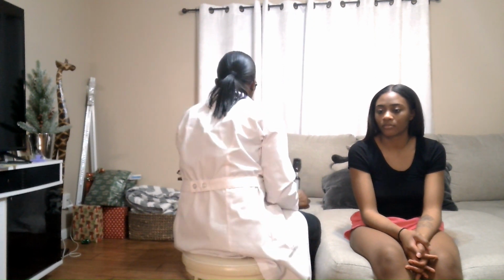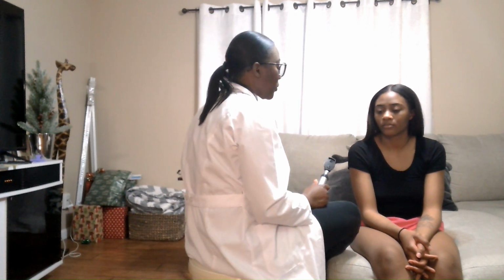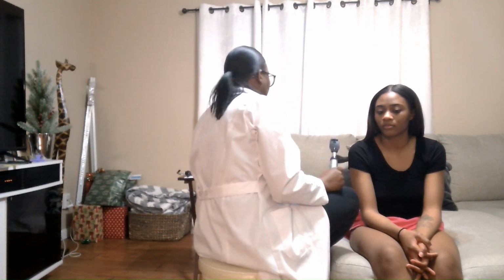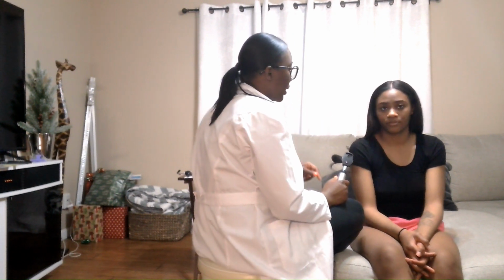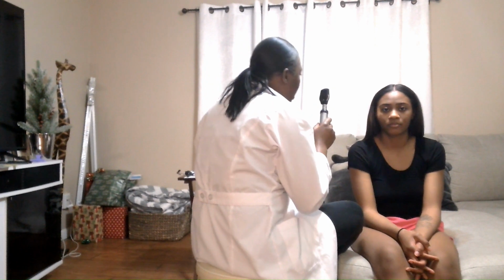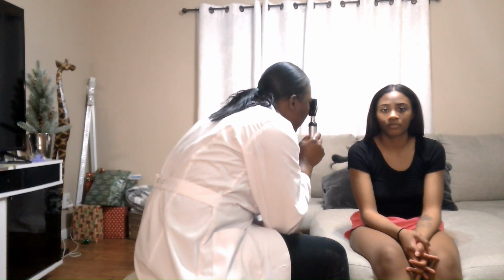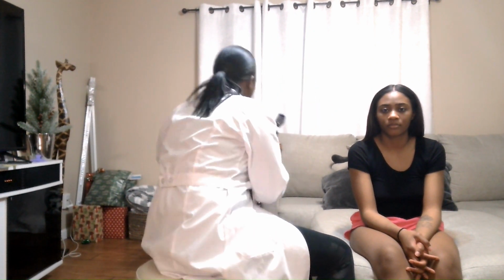I'm going to be looking at your lens, checking the red reflex, looking at the back of your eye, looking at your blood vessels, and also looking at your macula. So I have you look straight ahead. I'll take off my glasses to do this. I'm just checking for the red reflex, and I do see that.